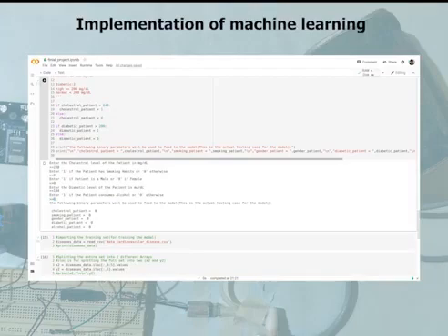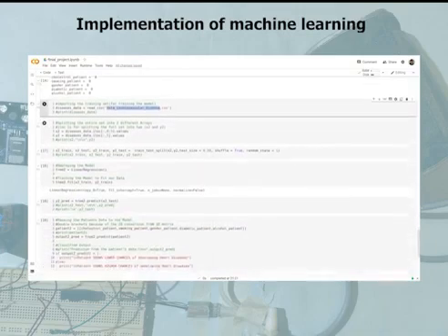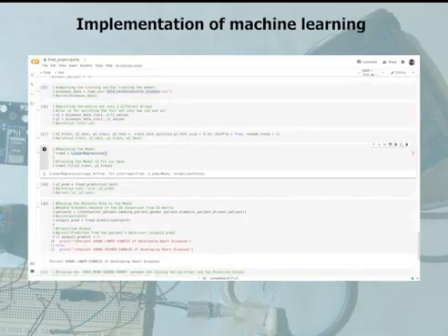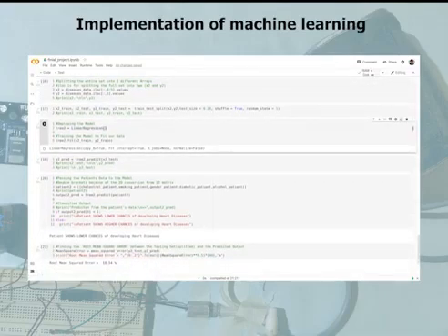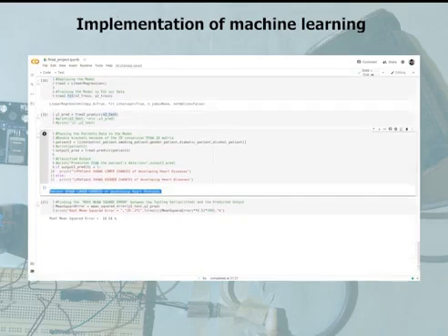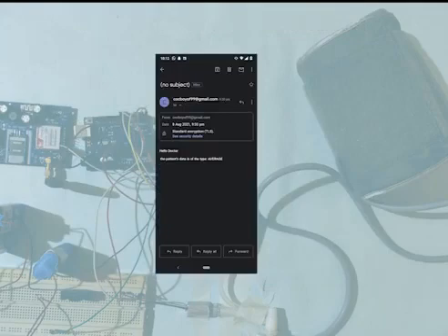Here in this cell, we have imported the training set into the script. Below is a process similar to the previous model, but here we use linear regression for a more efficient prediction. The model is then trained to fit our data, and the patient data is passed through the model. Finally, we get the output stating whether the risk is high or low. To evaluate the accuracy of our model, we have used root mean square error method, which outputs that the error is minimal. Here we can see the automatic email which is generated by the Python script.